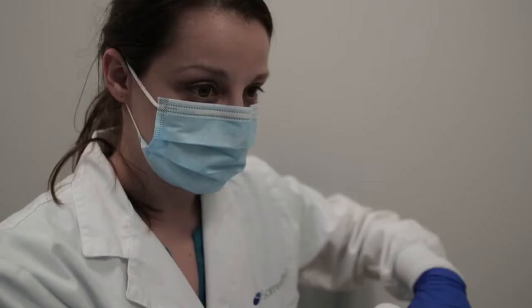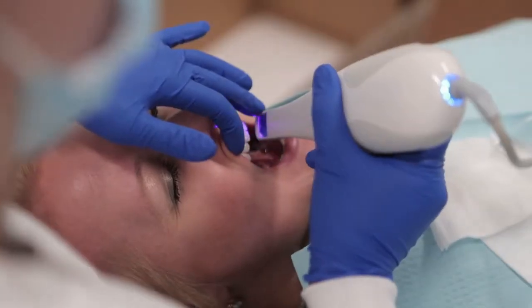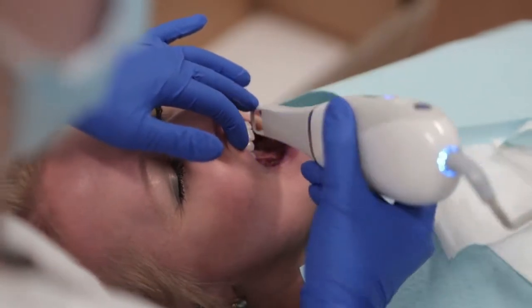You can also choose to do this using a scanning device. There are multiple scanning devices you can use when you work with Somnomed, which is really cool. They accept scans from lots of different players in the industry, which means if you own a scanner, you don't have to go buy a new one — you can continue to use what you already own, which you're already comfortable with at a high level.